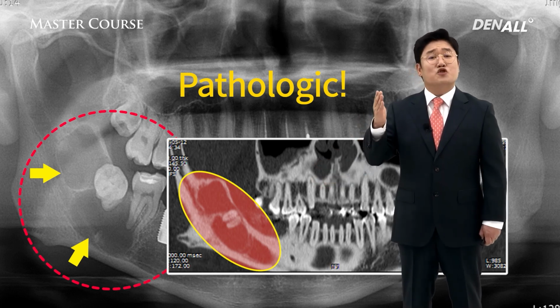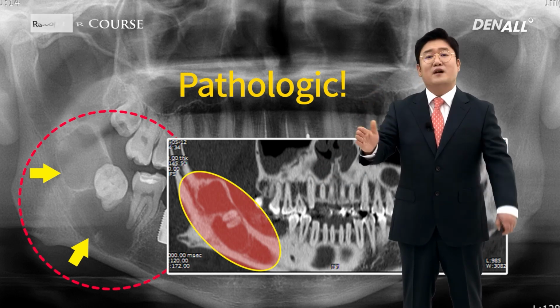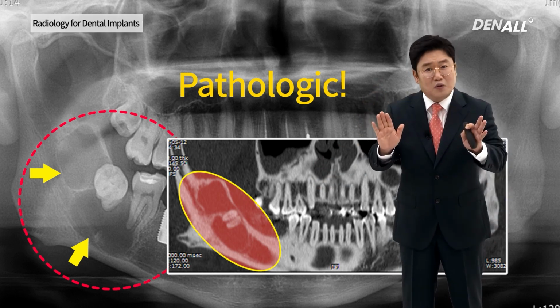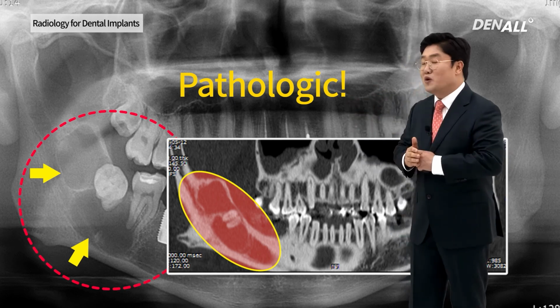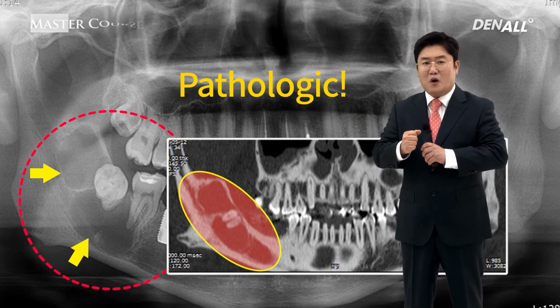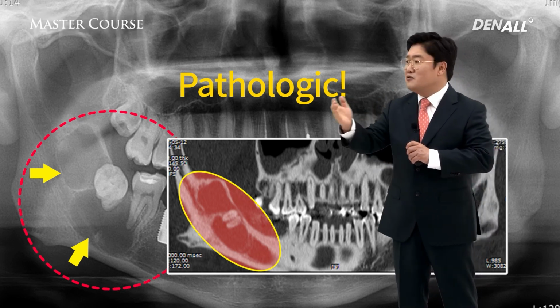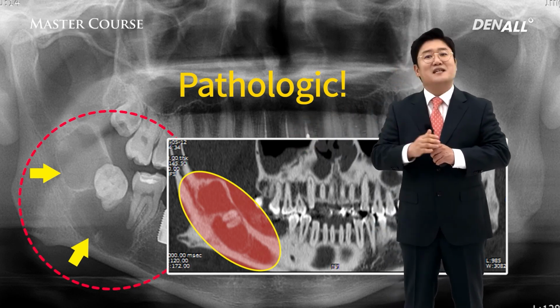Panorama, very important daily procedure. CBCT is around, but still for implant surgery or surgical planning or to check the outcome of the surgery, panorama is very important. If something is off, if an unfamiliar structure is observed, we need to remember that we need to suspect that.